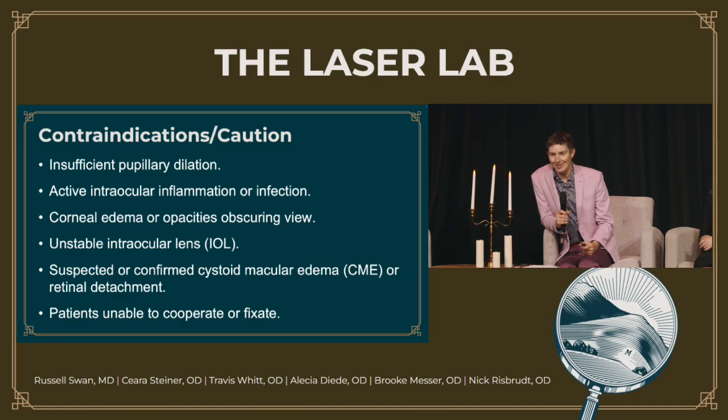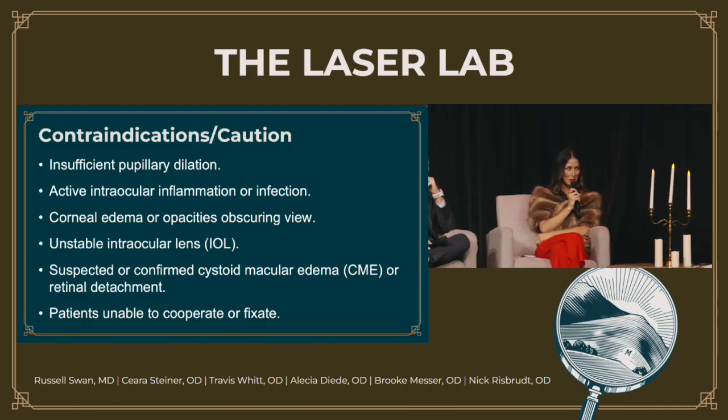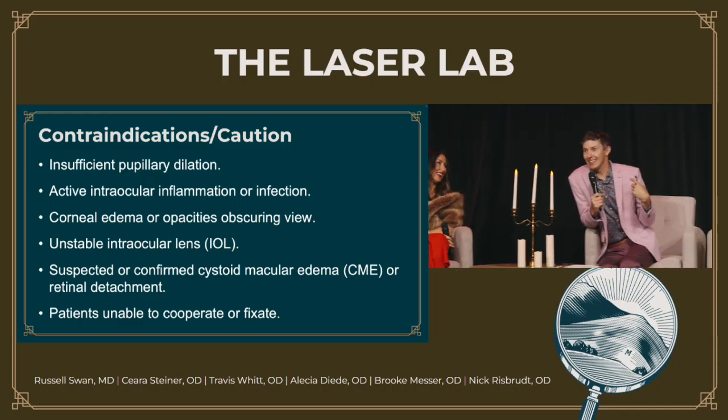Contraindications and cautions: unstable intraocular lens. Sarah, do you want to talk about my most embarrassing YAG that I've ever done? Do you want me to? No, I'll take it. So we're going to have some slides at the end.